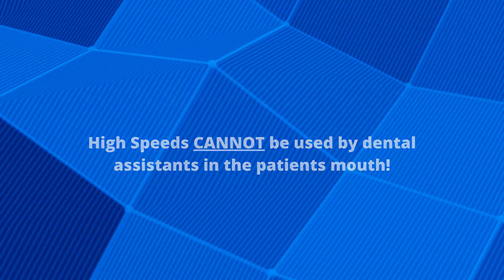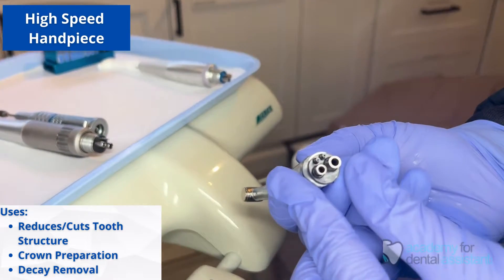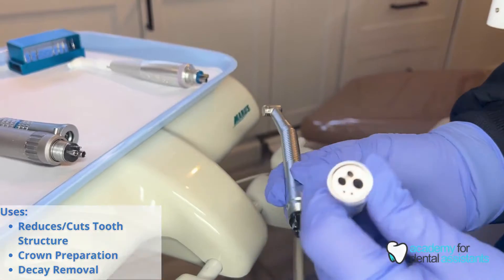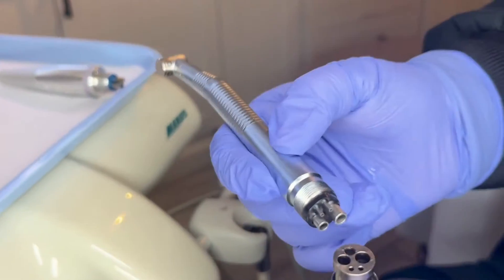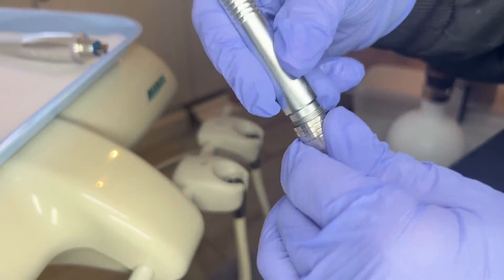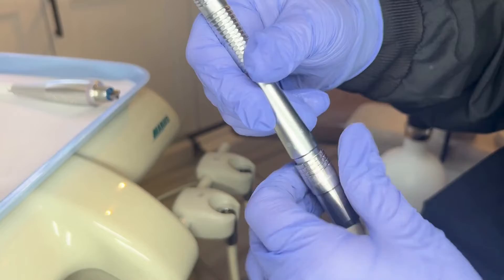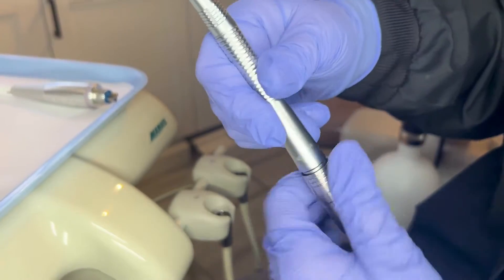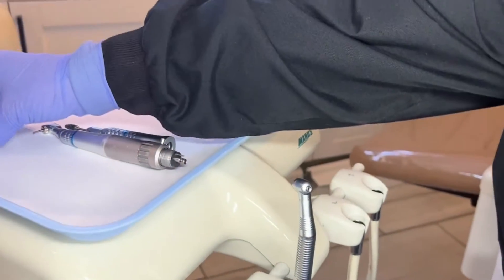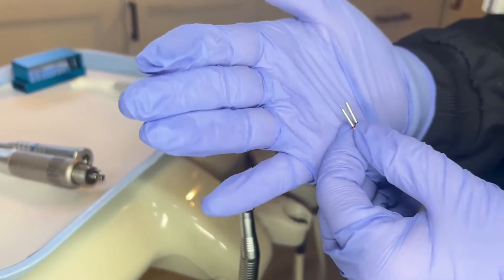The high-speed handpiece is only used by a dentist and it's used to reduce and cut down tooth structure, prepare the tooth for a crown, or remove decay. Initially you need to first attach the high-speed handpiece to the dental unit by lining up the holes at the bottom of the motor to the attachment on the dental unit. You would then take a burr to insert into the high-speed handpiece.